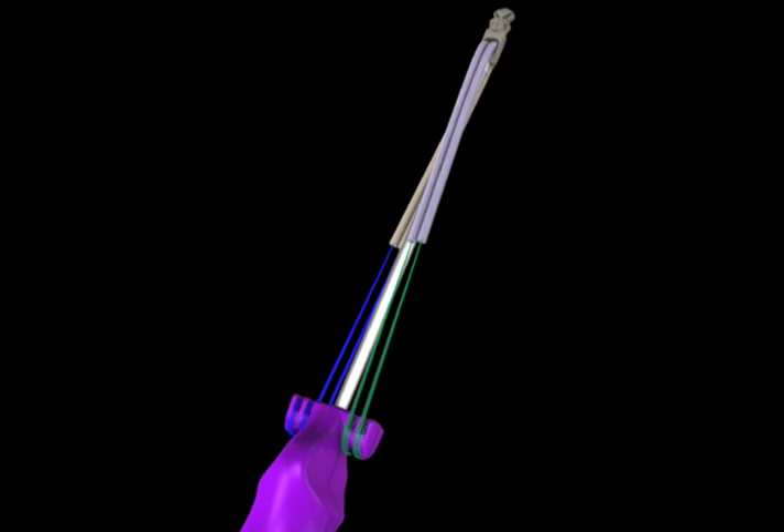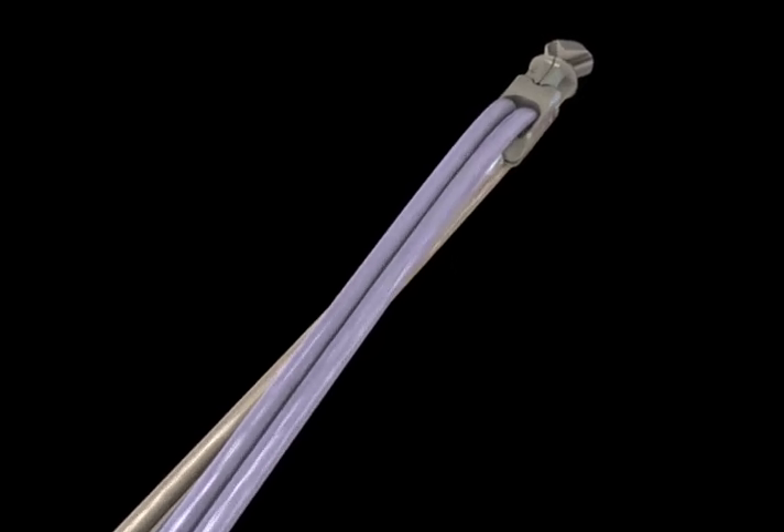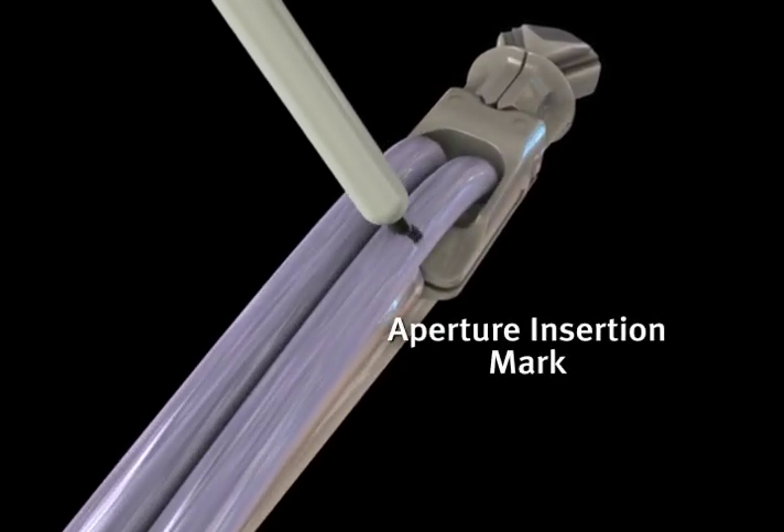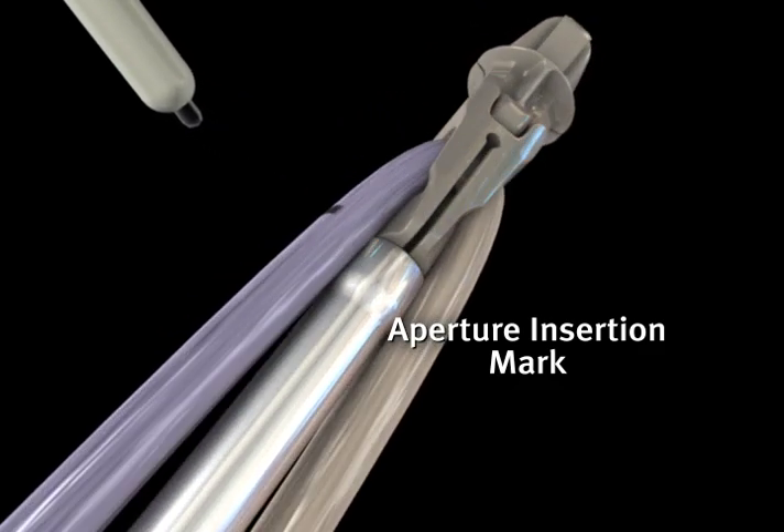The tendon bundles are then marked at the inferior edge of the implant, serving as a depth indicator when inserting the implant into the femoral socket.